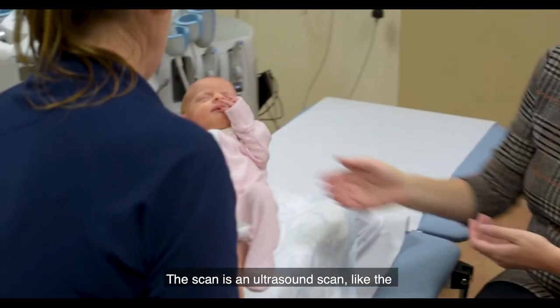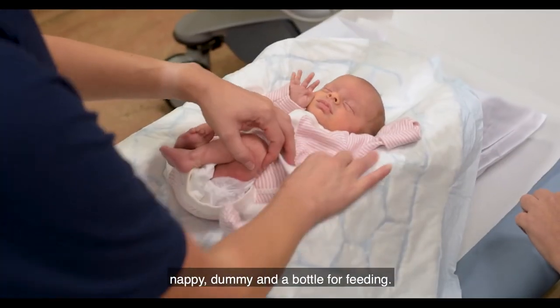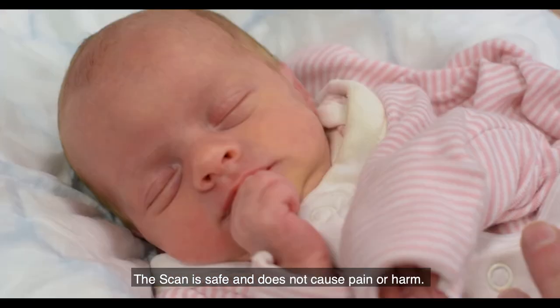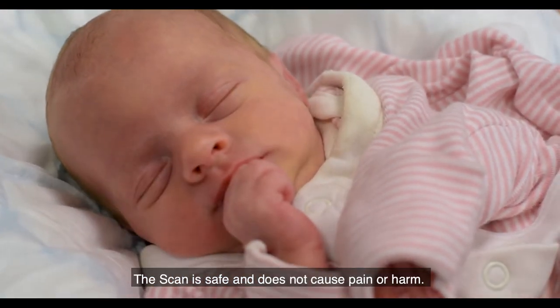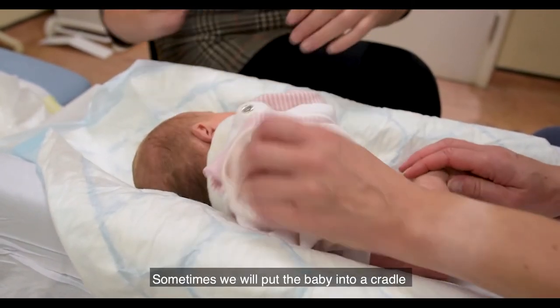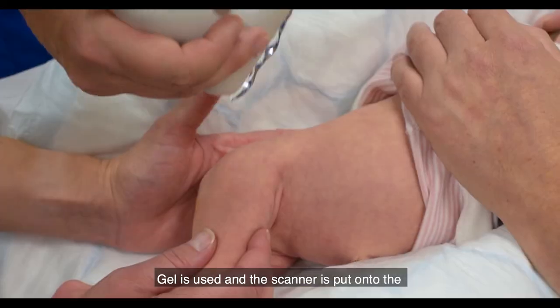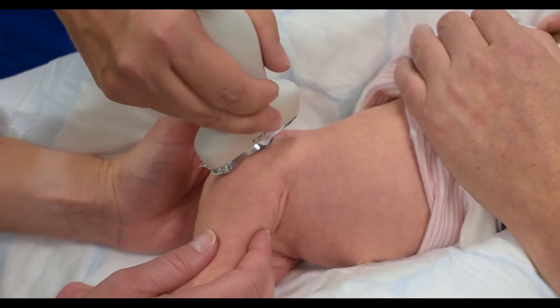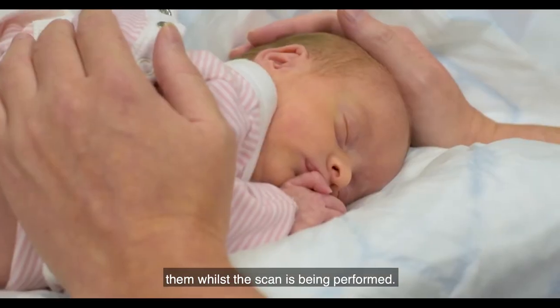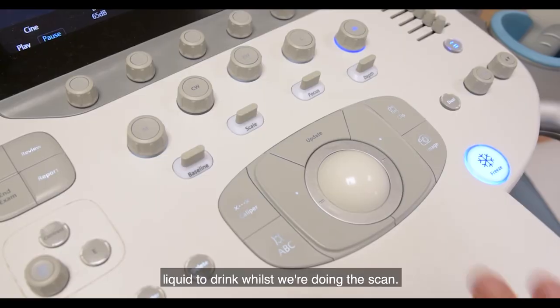The scan is an ultrasound scan like the scans done in pregnancy. Bring your normal baby clothes, a change of nappy, dummy, and a bottle for feeding. The scan is safe and does not cause pain or harm. Both hips are scanned even if only one hip is affected. The baby is undressed and lies on their side. Sometimes we'll put the baby into a cradle to support them. Gel is used and the scanner is put onto the side of the hip. You can comfort your baby or bottle feed them whilst the scan is being performed. Sometimes we can give your baby a sugary liquid to drink whilst we're doing the scan.